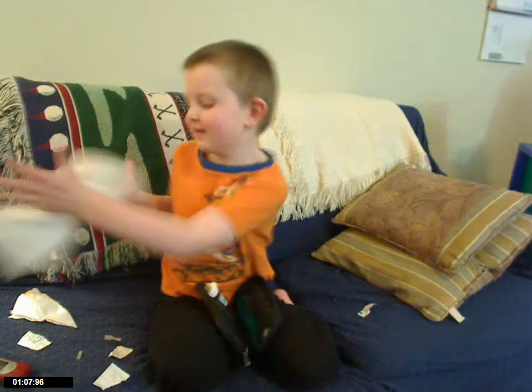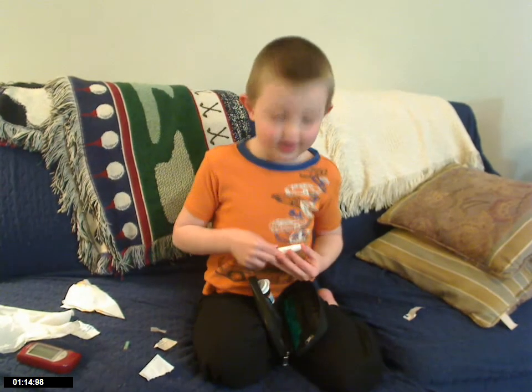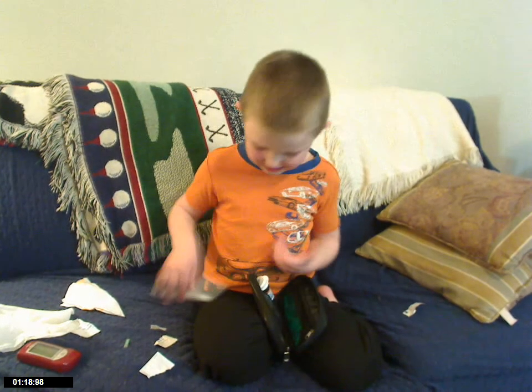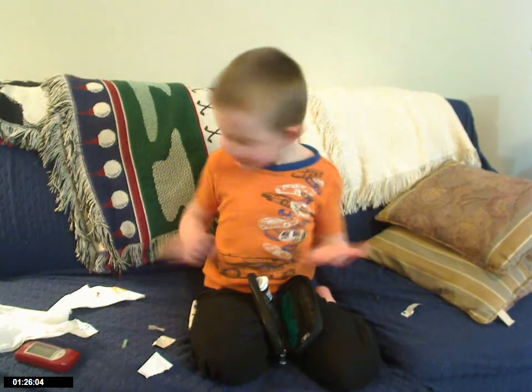And then you prick your finger. And then what are you pricking it with? Is that a needle? Inside it, yes. Does it hurt? No, it doesn't hurt at all. Then we wipe it on that.